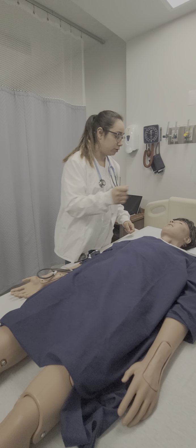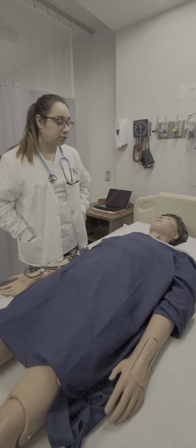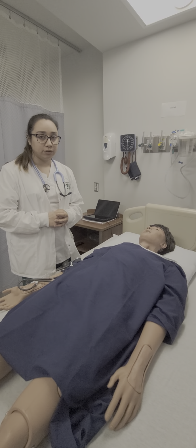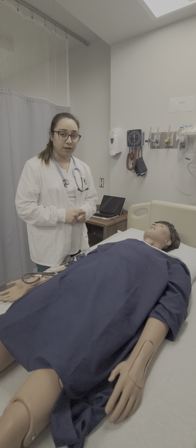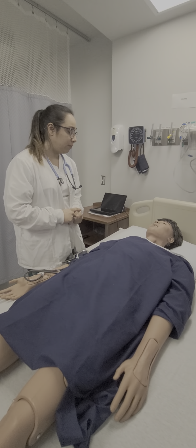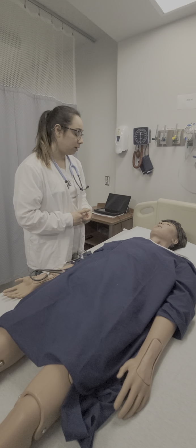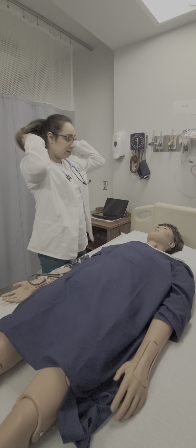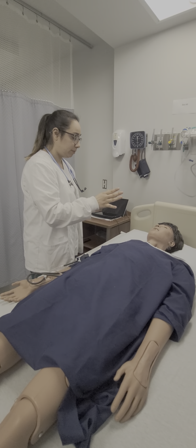I'm now going to take an oral temperature. Okay, oral temperature was 98 degrees. I would not take an oral temperature had the patient had any sores or lesions in the mouth or any mouth infection. I would then either take a temporal or tympanic temperature.